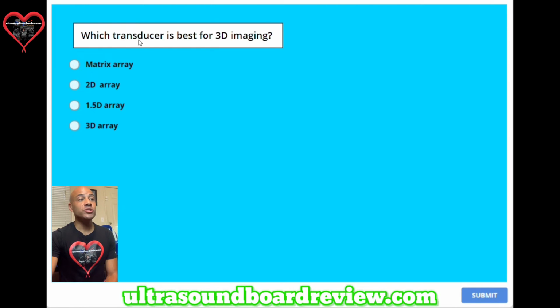Question 19. Which transducer is best for 3D imaging? A, matrix array. B, 2D array. C, 1.5D array. Or D, 3D array. The answer is B, 2D array.